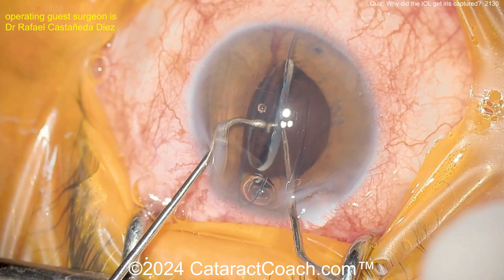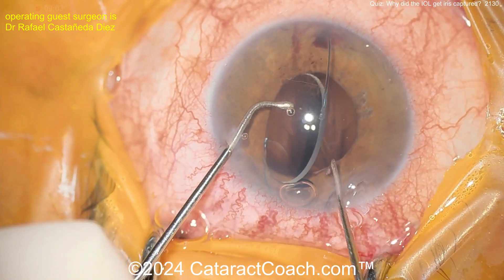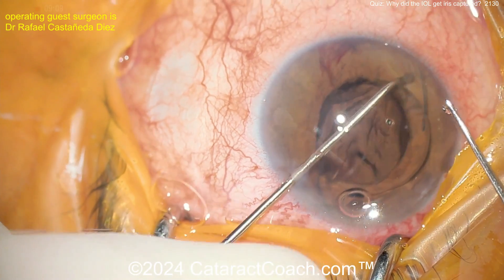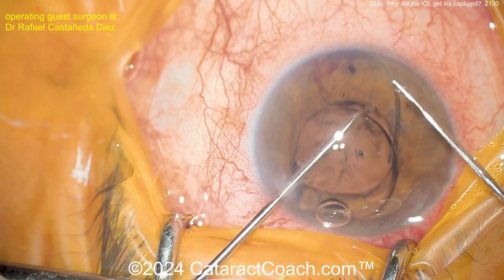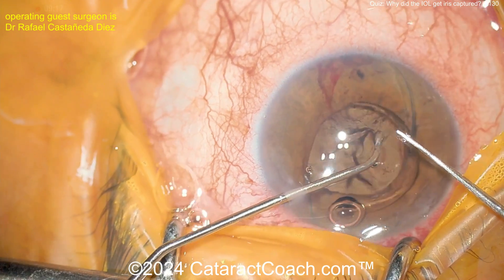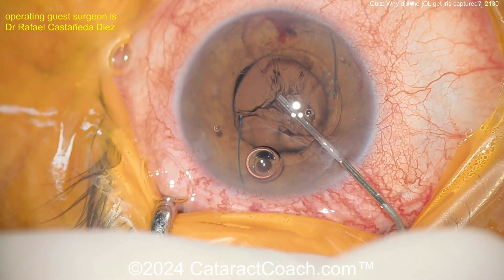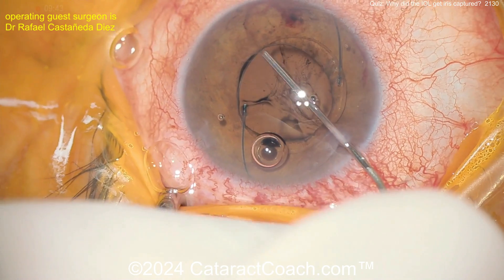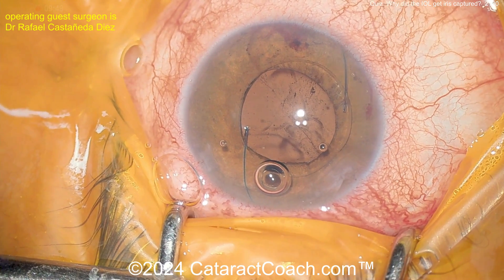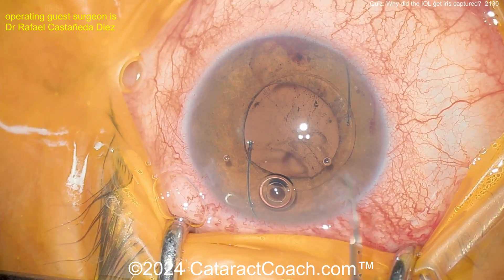You can flip the lens in the eye, but be careful not to scrape the corneal endothelium. Now the lens is being flipped — hopefully this is a big eye with a deep AC and plenty of room. Now the lens is in the correct orientation. If you put the lens in upside down, the optic is vaulted forwards and wants to come through the pupil. In the correct orientation, the optic is posteriorly vaulted due to the angulation at the haptic-optic junction.